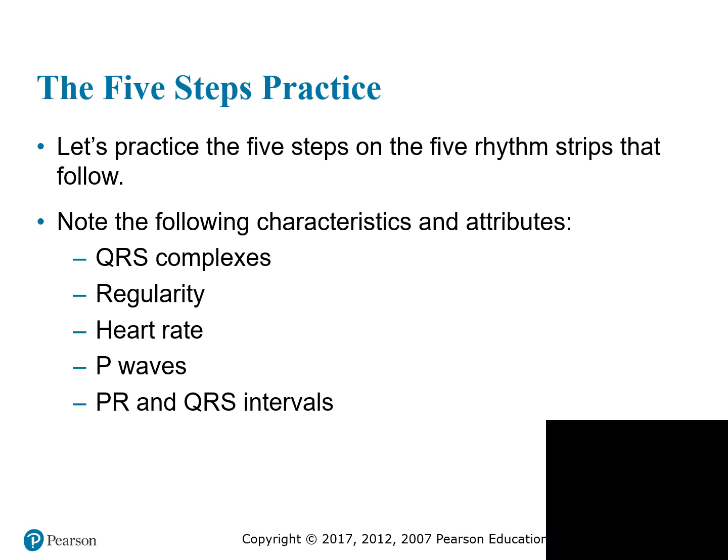Always remember, once you finish calculating, to put seconds behind it, because if you give me an answer like 0.44, I'm going to ask, what, apples, millimeters, centimeters, seconds? Same thing when you're determining heart rate. Always remember to put BPM at the end. Same thing with the QRS complex. It goes from the beginning of your Q to the end of your S, meaning right at your J point, just before your T wave forms.